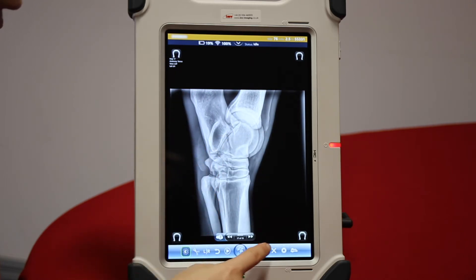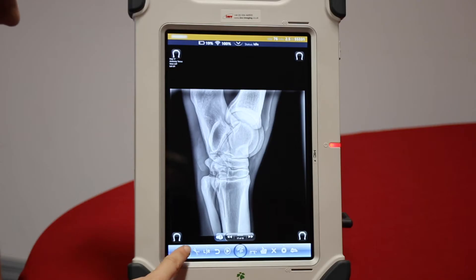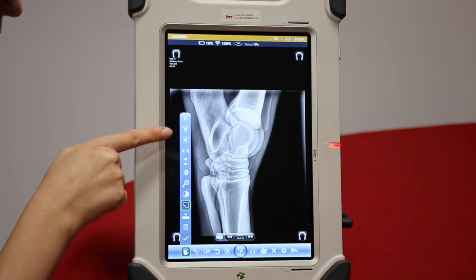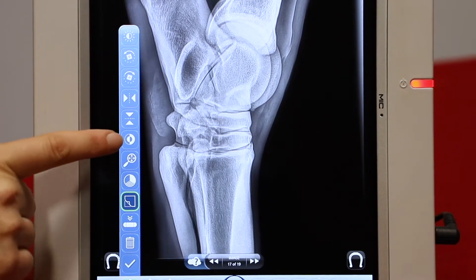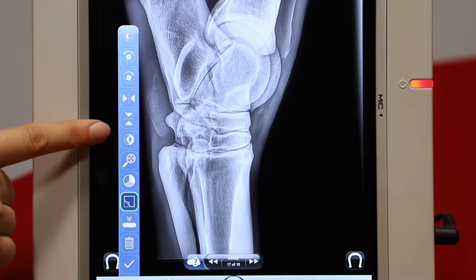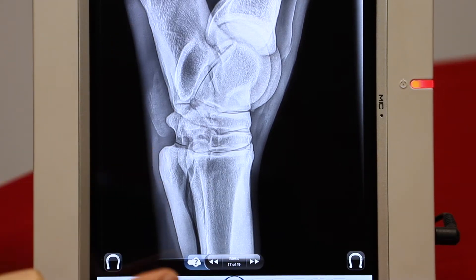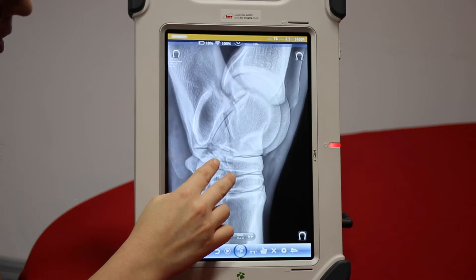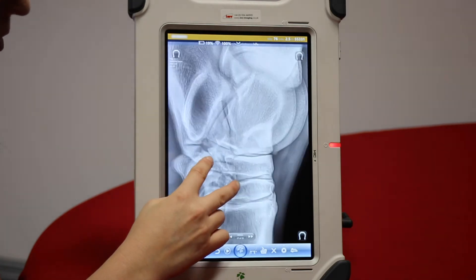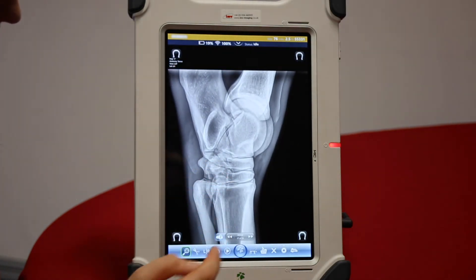After any change, press Save to save your changes. Here we have Flip and Rotate, and we have Invert. The Zoom tool — once pressed, just use your fingers like a phone to zoom in on the image. Again, any changes, press Save.